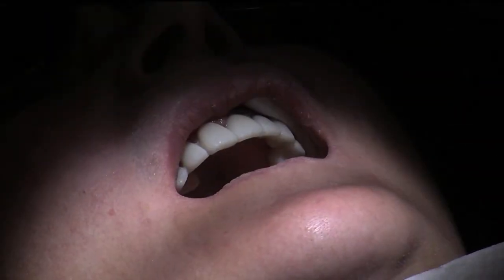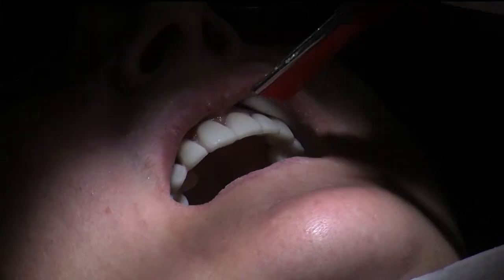Then I switch and just dry the teeth slightly. I'm going to use the red paper now — tap up and down, which is a lot thinner. And tap this side again — tap, tap, tap.